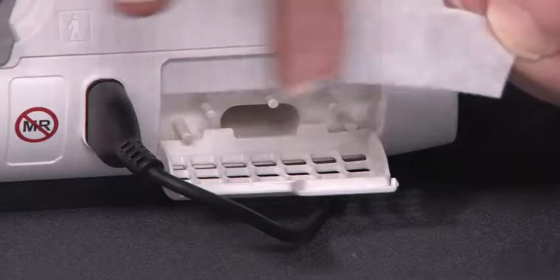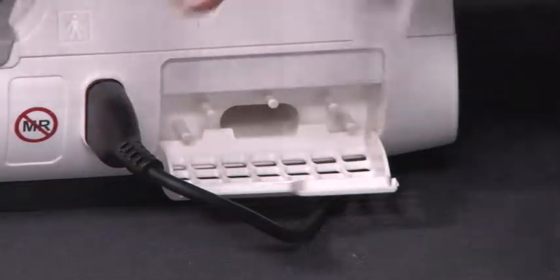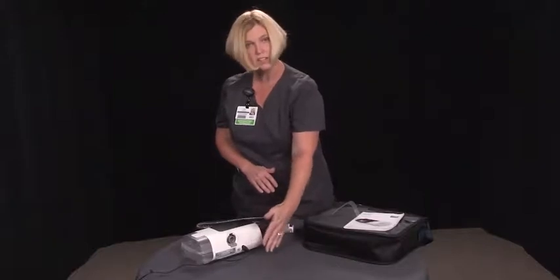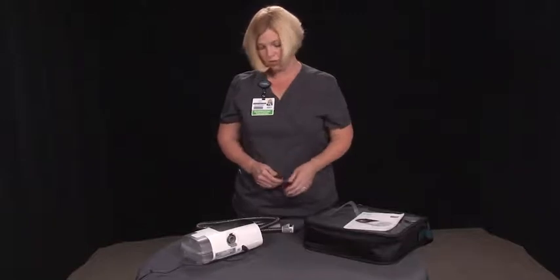About once a week, you should take this filter out and just gently brush it off from any dust that might have accumulated. You also want to leave this area clear for the air to be able to flow freely to your CPAP machine.